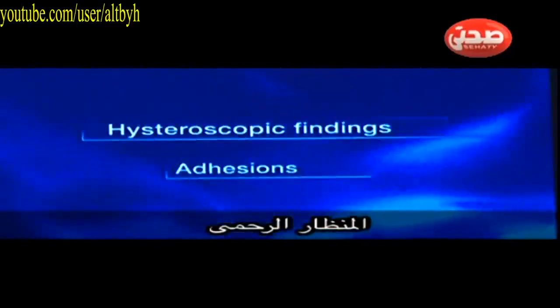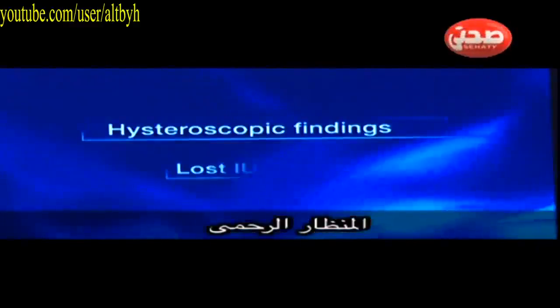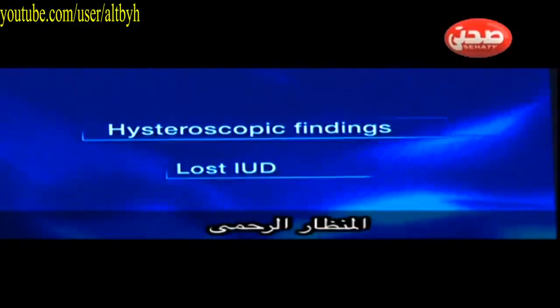Adhesions is also an important finding of the uterus, and you always have to comment whether there's adhesions or not, especially if she had subfertility, or she had a history of hypomenorrhea or dilatation and curettage. Lost IUDs is also one of the indications to do a hysteroscopy to try to remove it. As you can see here, there's a misplaced and missed IUD, which was retrieved successfully.